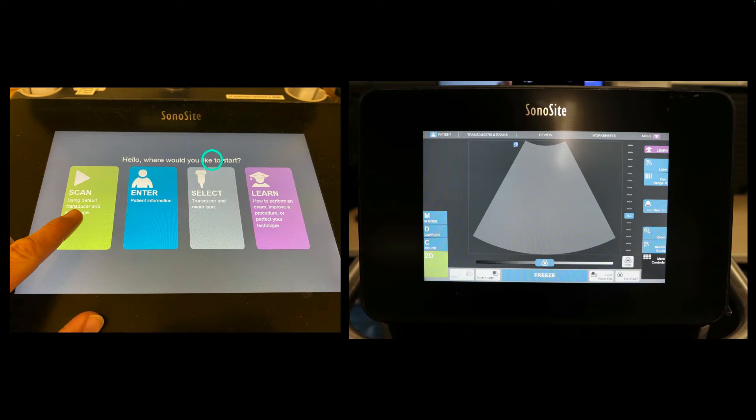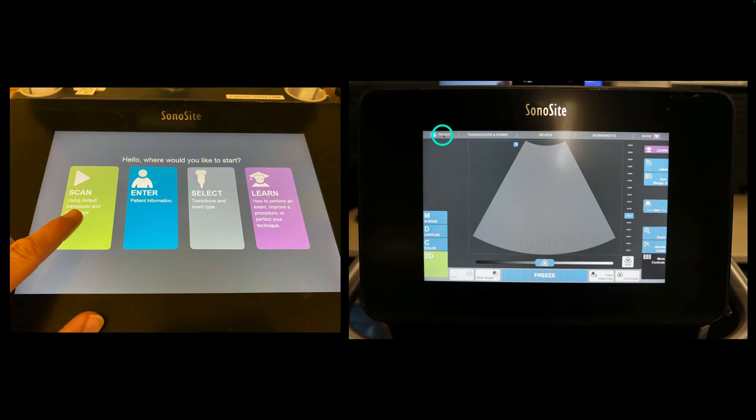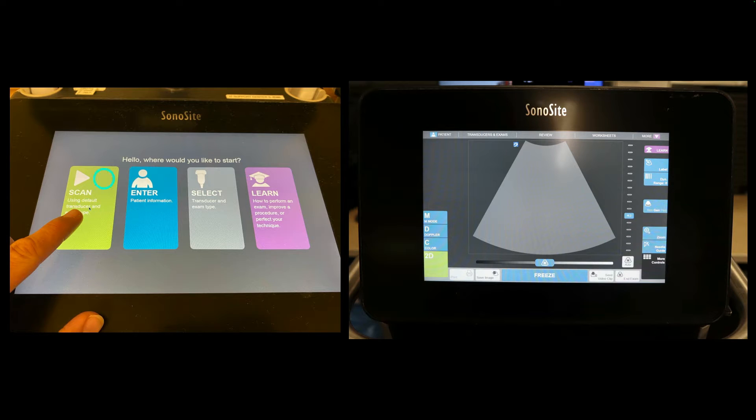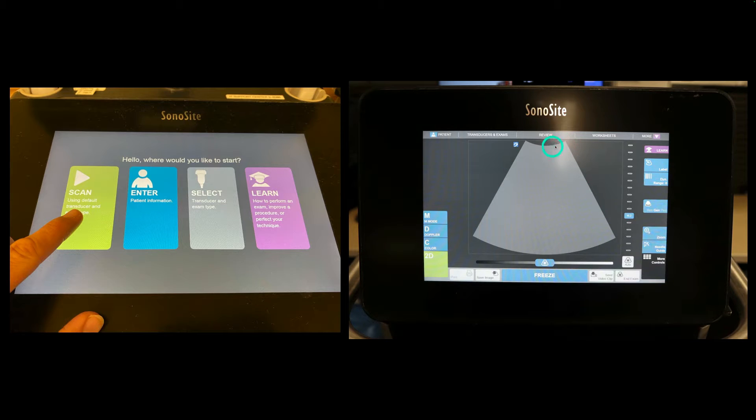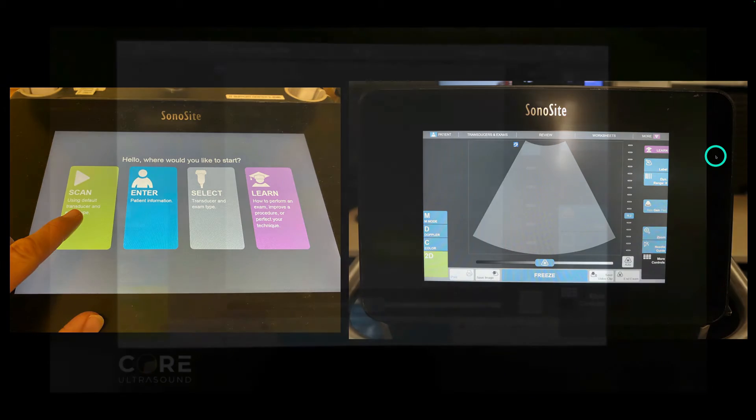Now there's a lot of similar stuff here. So we have enter patient information. That's this button and it's all touchscreen. We have select transducer type, which is actually this one right here. And if we hit this button, it will just take us to this screen defaulting to whatever the last transducer used was. In this case, a curvilinear transducer.